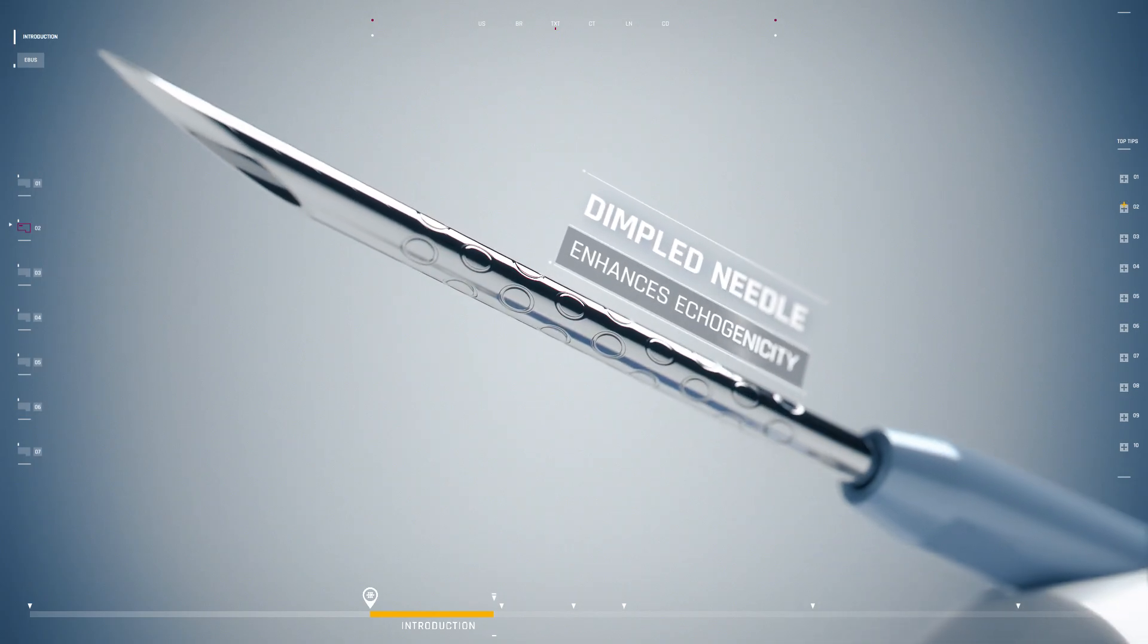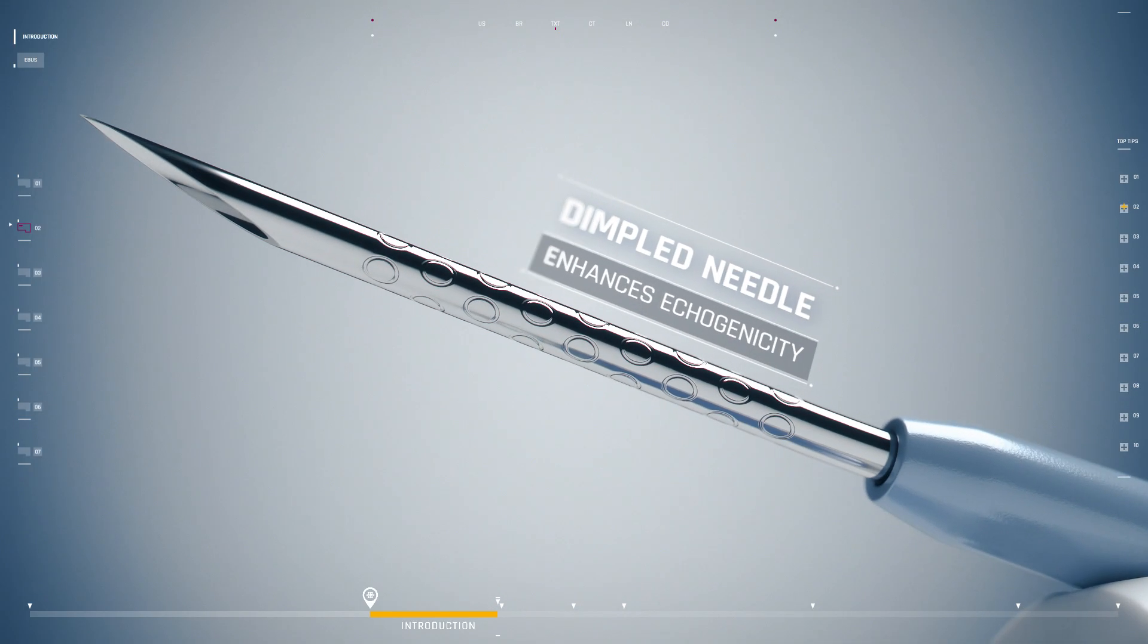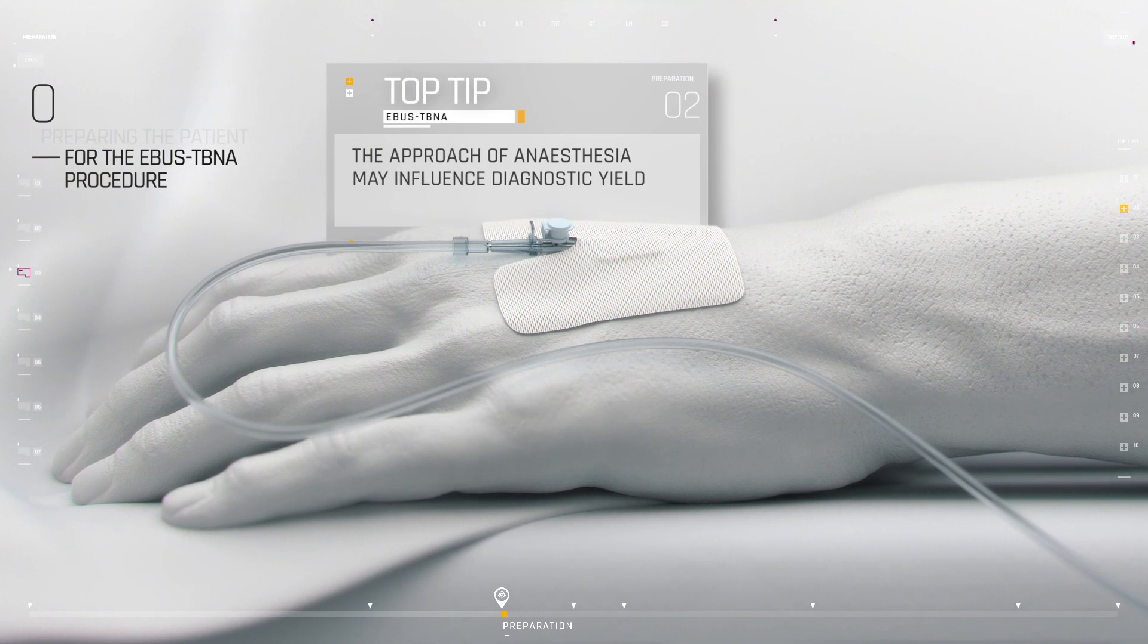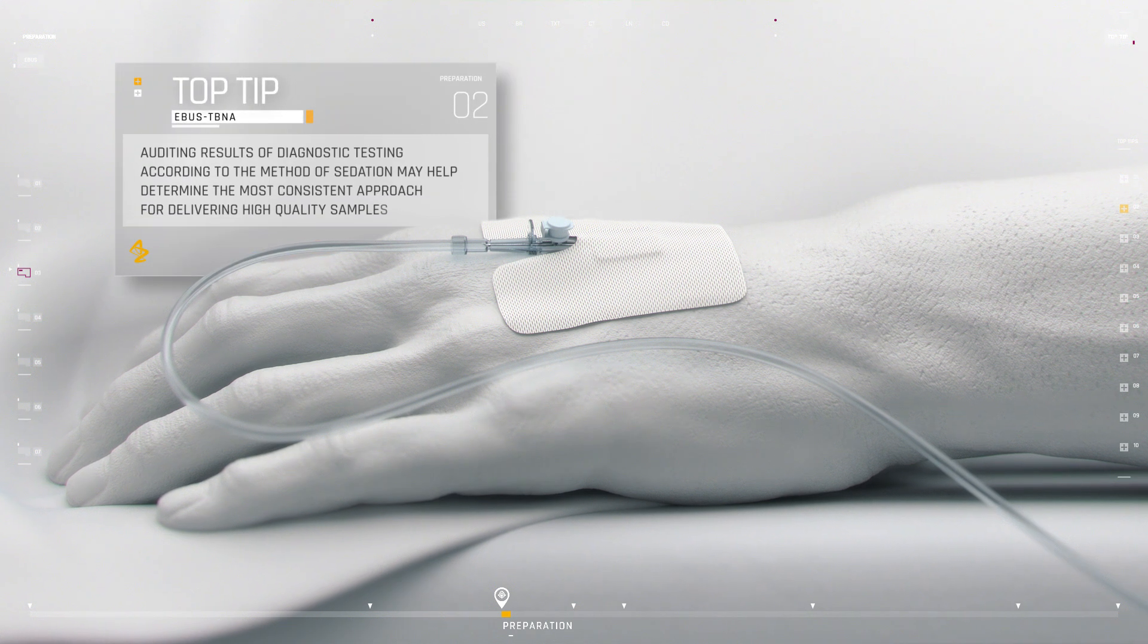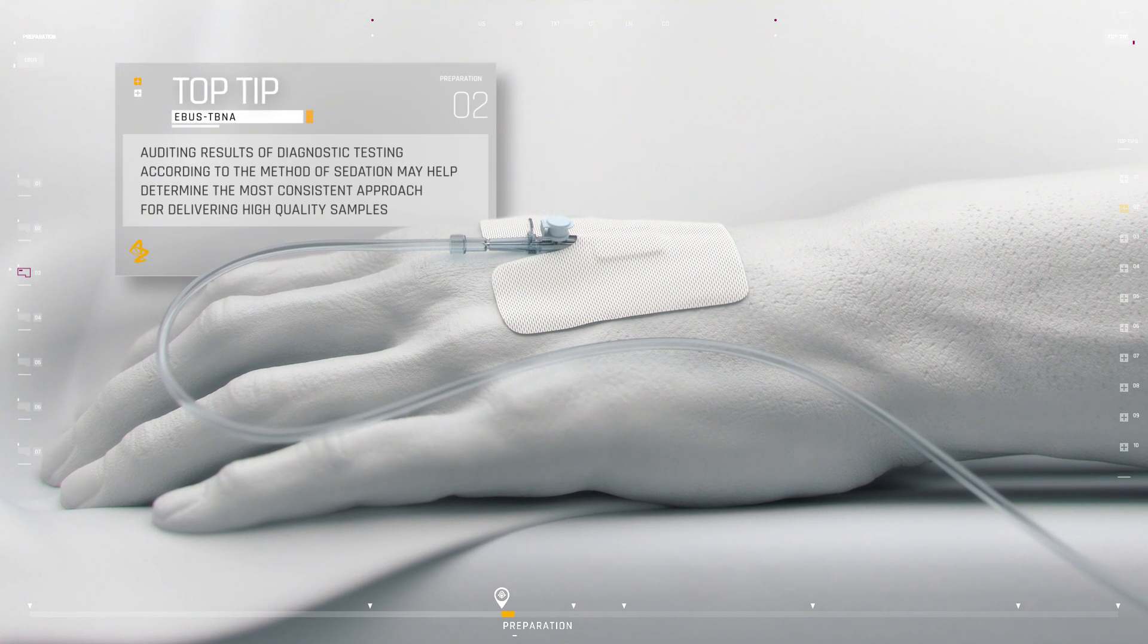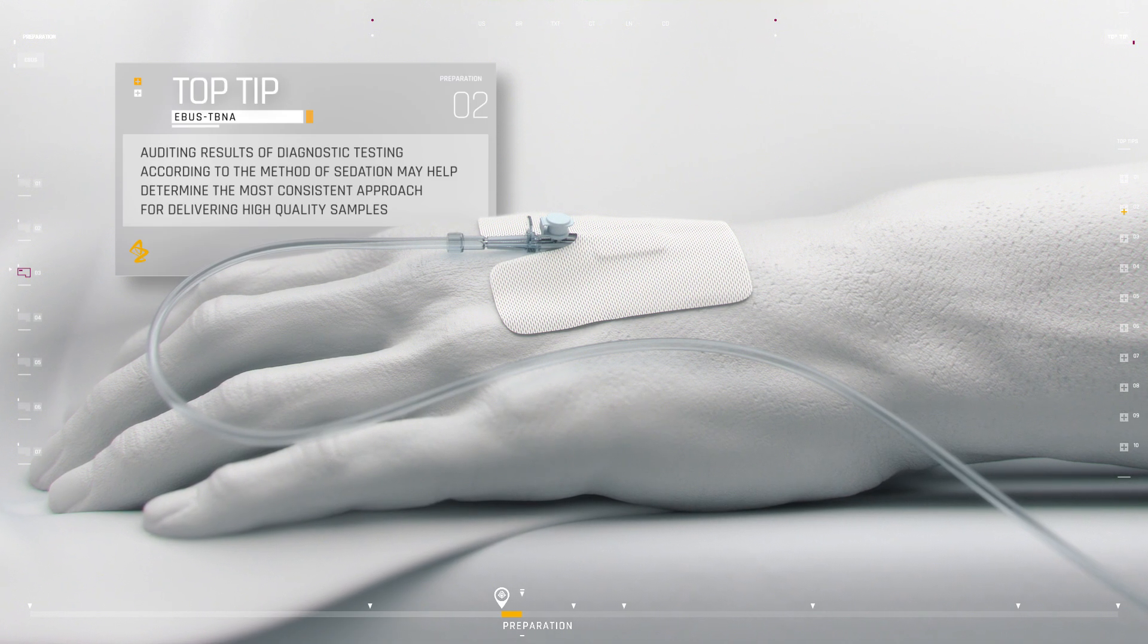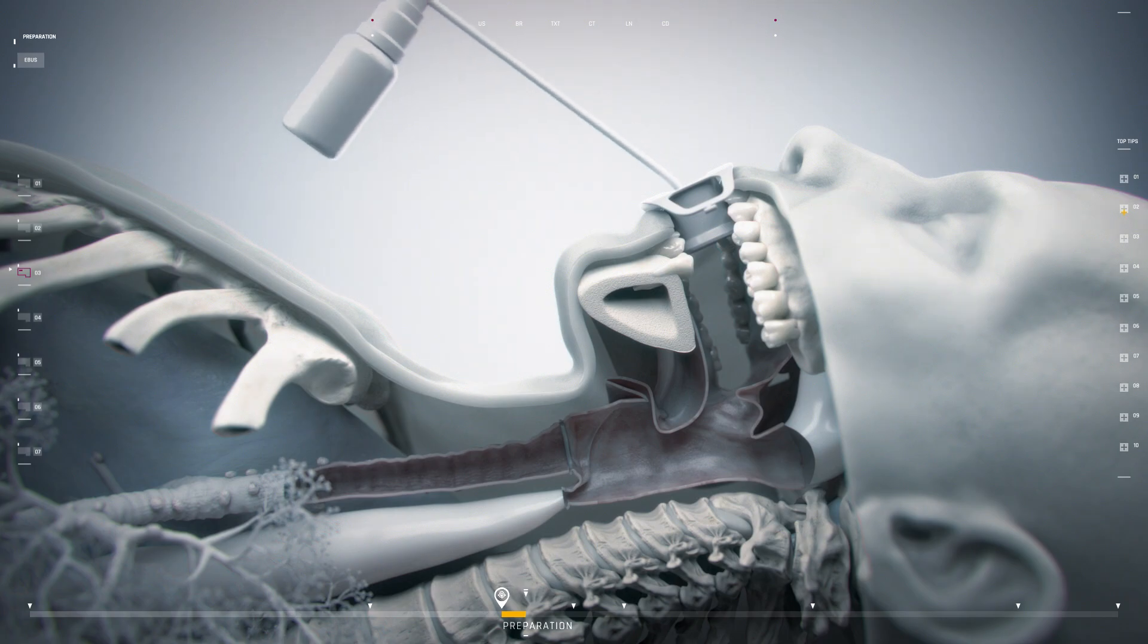The EBUS procedure may be performed under conscious sedation, deep sedation with anesthetic support, or general anesthesia, depending on the anticipated length of the procedure and local practices. Local anesthetic is administered to minimize coughing and discomfort.